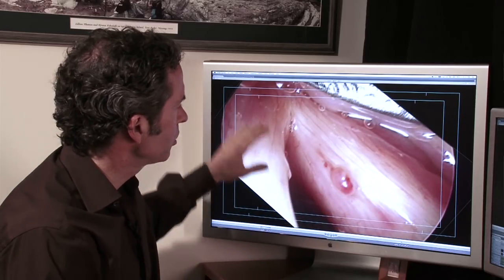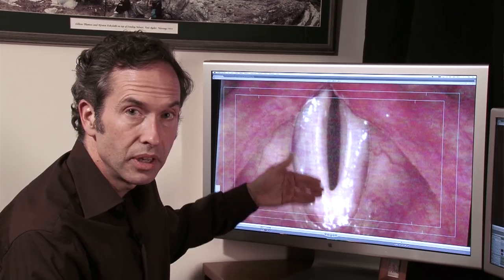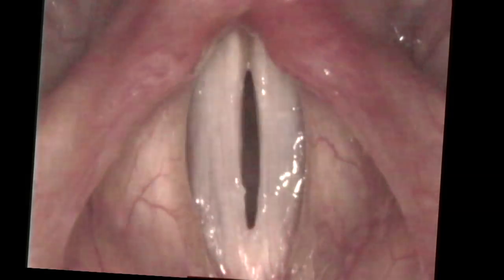During surgery, we put the laryngoscope in and get a close-up view of that hemorrhagic polyp, then cut it off with a pair of scissors. There'll be a little more bleeding with scissors than with a laser, since the laser seals tissue as you go. Even so, this is a fairly minute polyp — perhaps only a sixteenth of an inch wide — so it's not even a lot of bleeding; it just looks like it under the microscope. A couple months later, the edges of the vocal cord are very flexible at both low and high pitches.